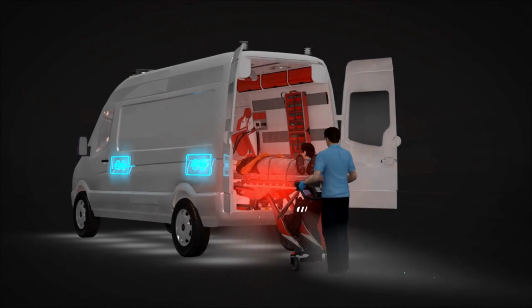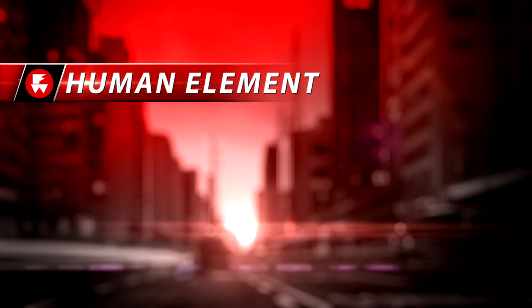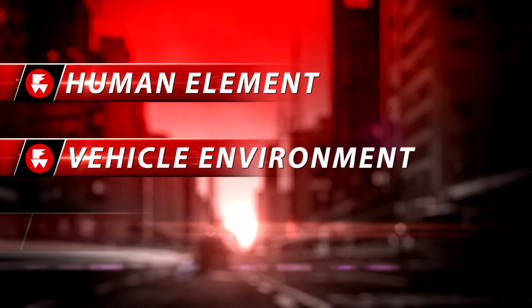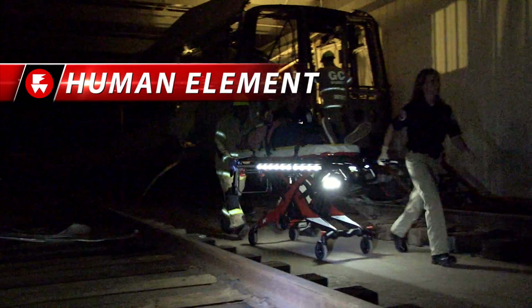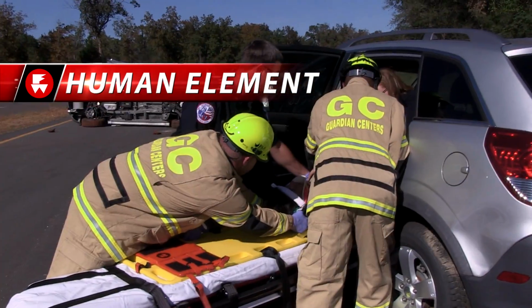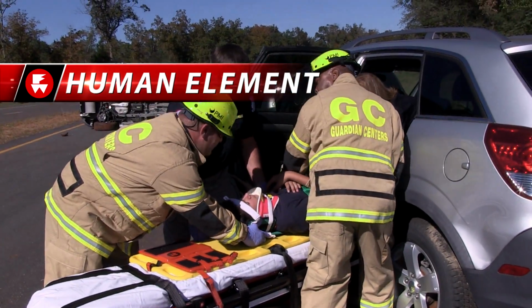The Integrated Patient Transport System is a development program. It's really based around 3 platforms: the human element, the vehicle environment, and the intelligence platform. The human element has 2 facets, that of the patient and that of the medic. So we worked on a patient surface, now called INX.